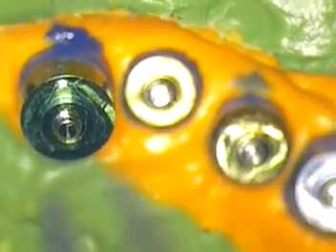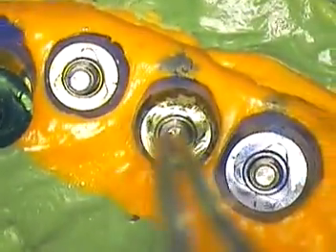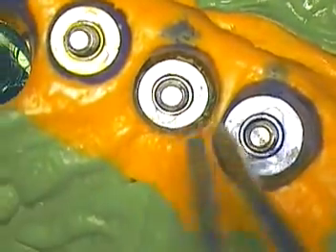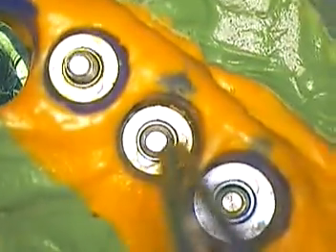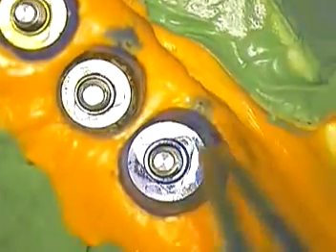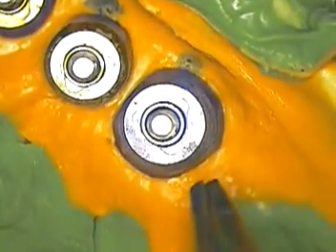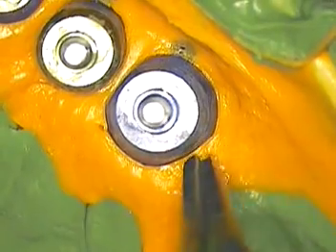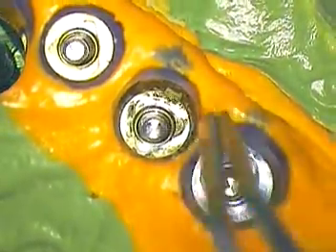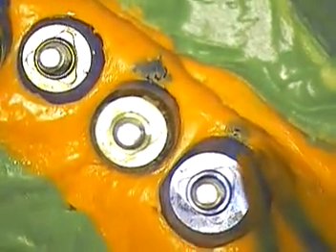I may have to modify some of the lab analogs in order to make these two not touch each other. On the right side here, we have the second bicuspid region — the number four position and the number three position. I tailored the design to mimic that of a molar. I probably could have brought this out just a little bit more to mimic the side, but it's a 5.0 and this is a 4.0 — I think a 4.3 implant. So we're all set.